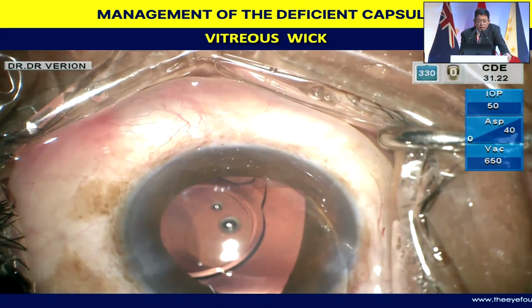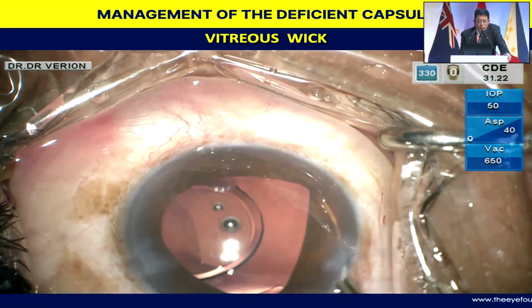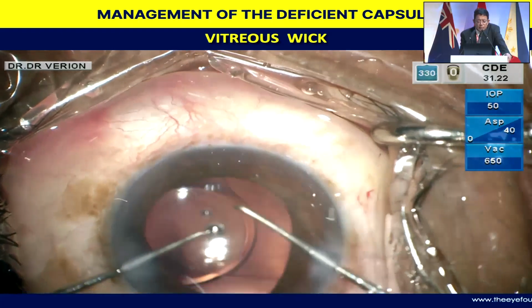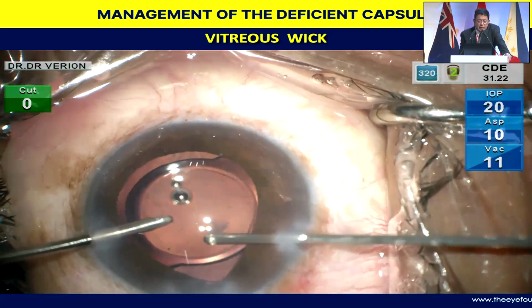This was not, maybe it's the trauma of the surgery, because it was not a pre-existent problem. So it's not a progressive zonulopathy that we have, but I just want to give enough circumferential support. So go ahead and inject an endocapsular ring.